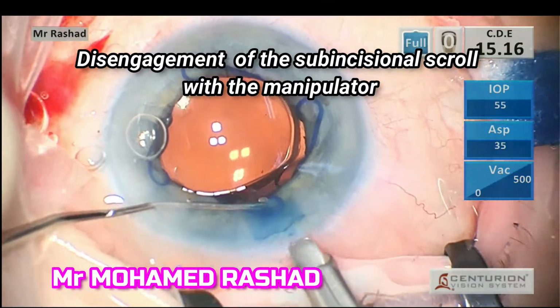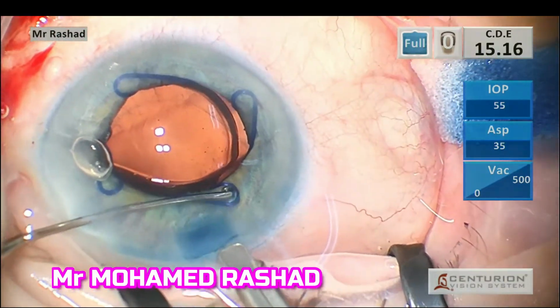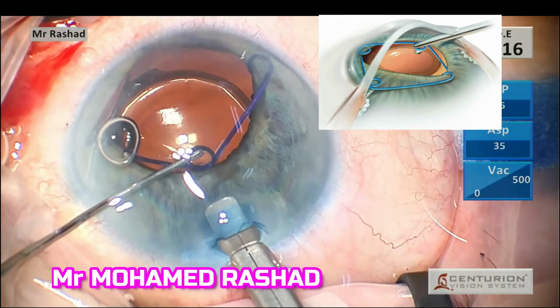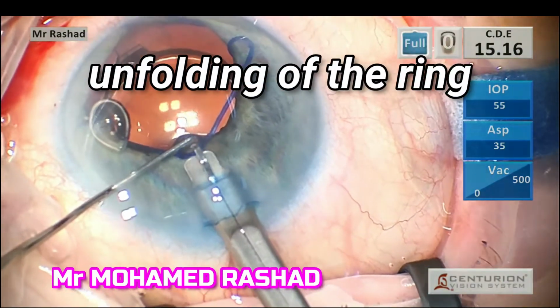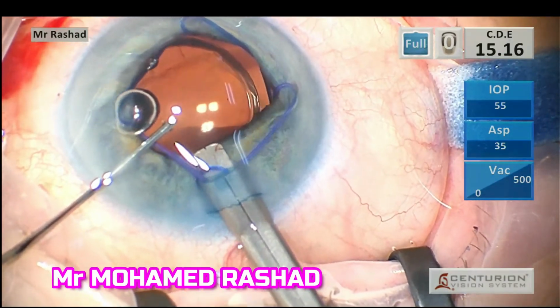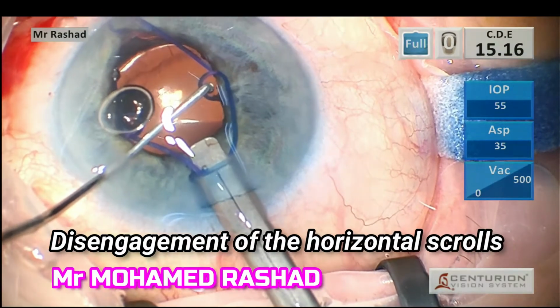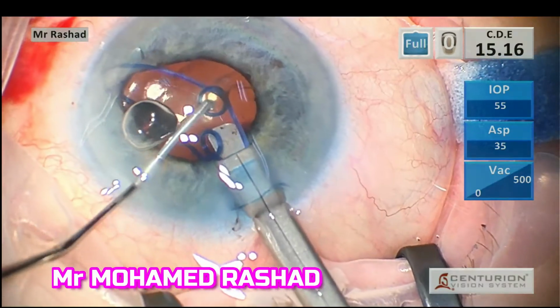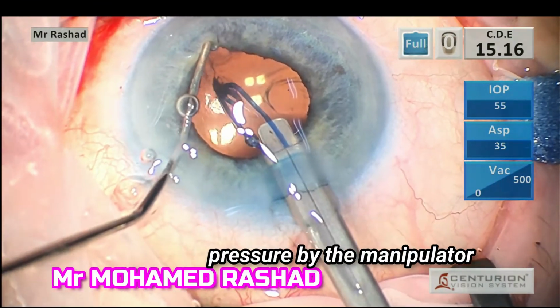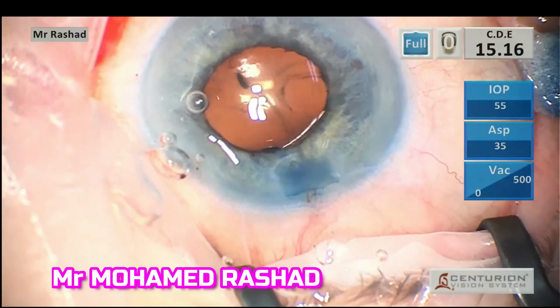disengaging the proximal scroll slowly without damaging the iris border, as shown here. Then I go with the injector and take it with the injector, then unfold the ring, and with the help of the manipulator you can disengage the horizontal scrolls as well while pulling the ring outside. The manipulator can help to counter press on the iris border so as not to damage the iris while pulling the ring. Now the ring is free and you can go outside the AC.